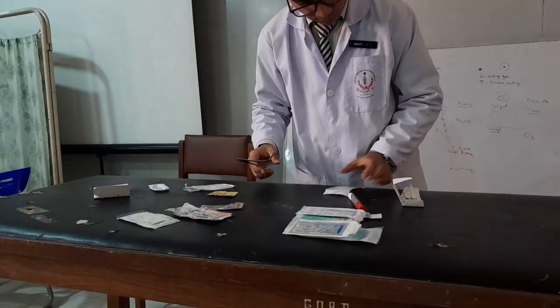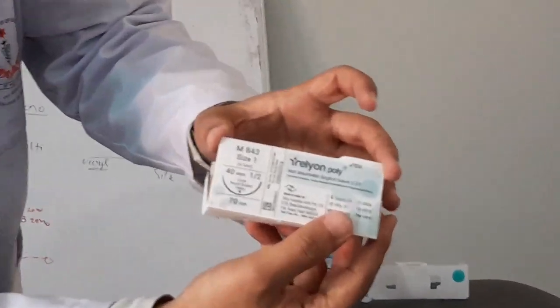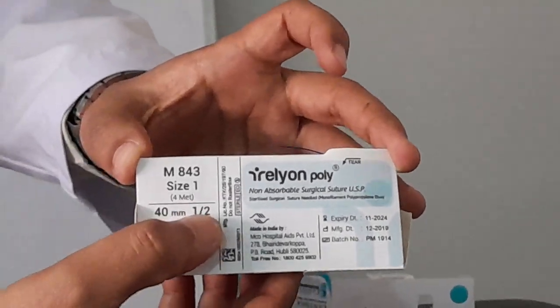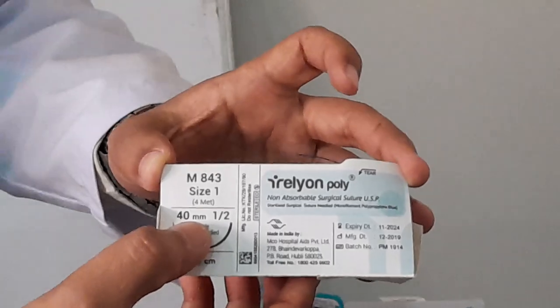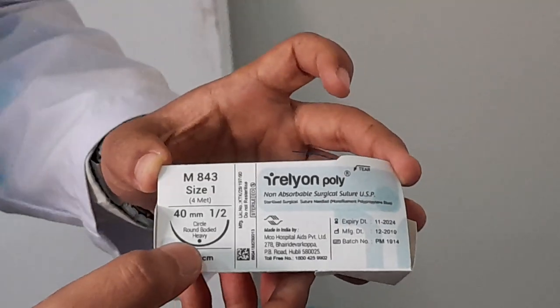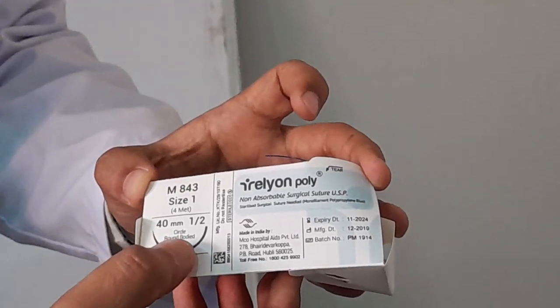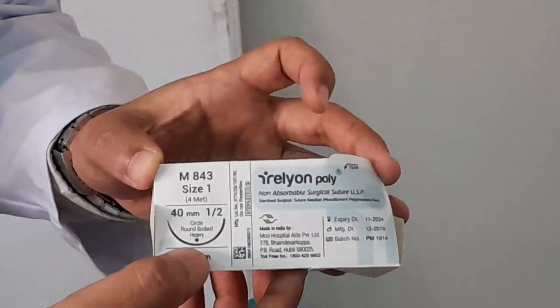Now we will look at the next suture material. Here we have the next example. You can see here it is 1/2, which means half of an arc of a circle. And here it is 40 mm, so the length of the suture needle is 40 mm. And it is round bodied. You see the round dot here, so it has a round body.